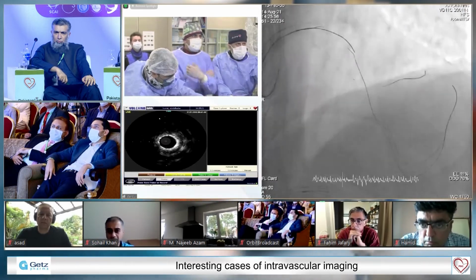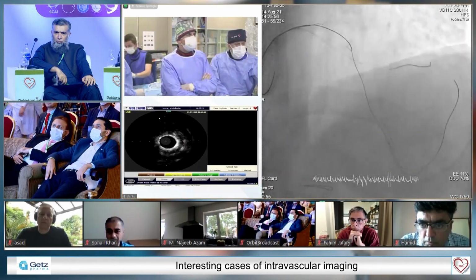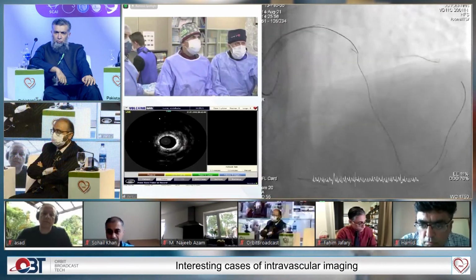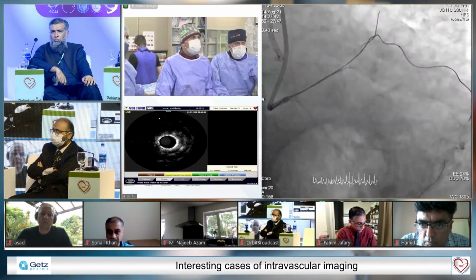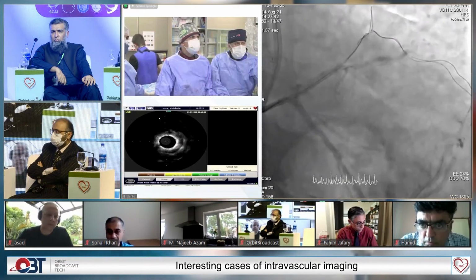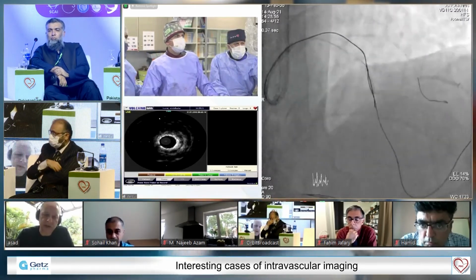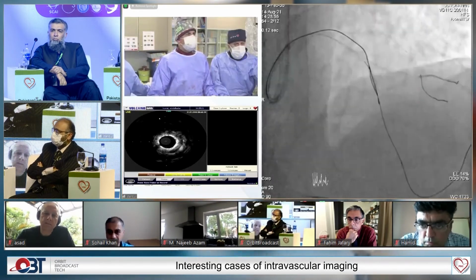And this is Gaia Second, the proximal and distal wire are in different plane. But I think we should trust more retrograde wire than antegrade wire. First, we like to do reverse CART. To do that, we did inflation of 2.5. So you didn't switch to a ping pong guide at this stage, put a second guide in? We did, after cross, we did. This is 2.50 for reverse CART.